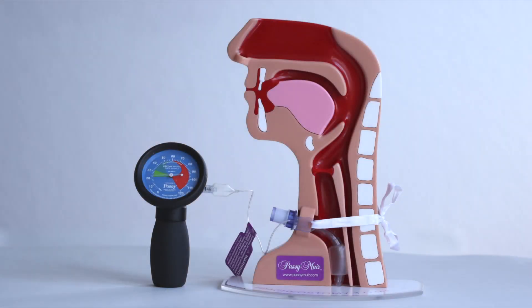Cuff pressure measurement. Cuff inflation should take place slowly to avoid overinflation. Measuring cuff pressure can help prevent overinflation.